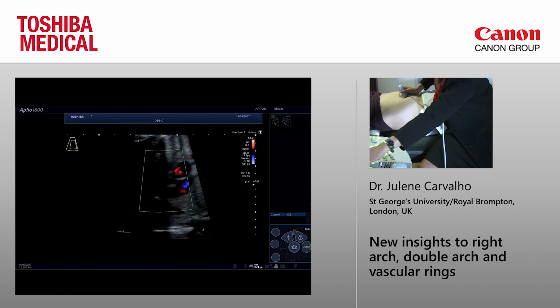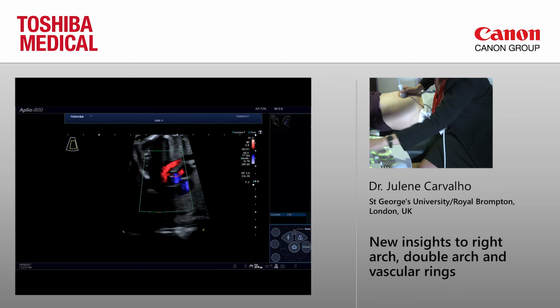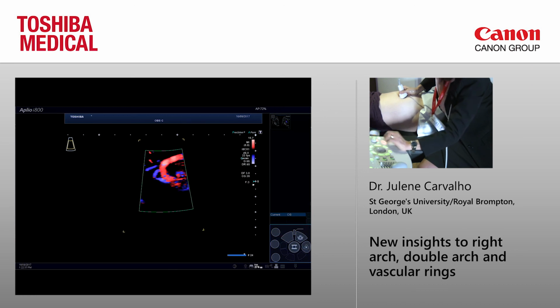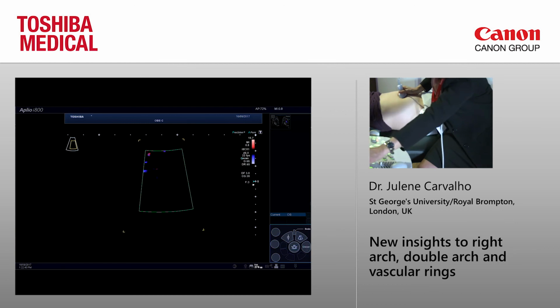I was just going to try and do something here for you to see, because I think it's a nice image if I can get there. So you see how easy it is, just cut down all your gain. Particularly if the patient is high BMI, sometimes this is a tool that I would encourage you to use. You don't have to pay extra on your machine, you just turn the gain down, so they can't charge you for that. So it's very easy to see the aortic arch and the branches. Yeah, so I think it's quite nice. So back onto the gains.